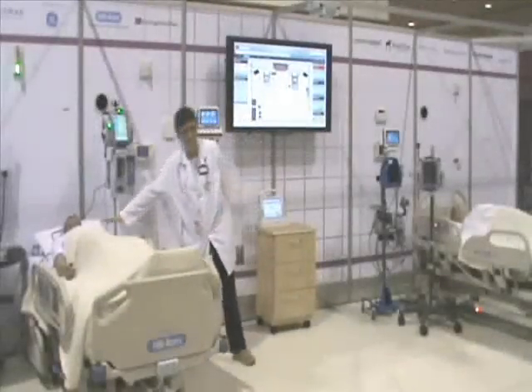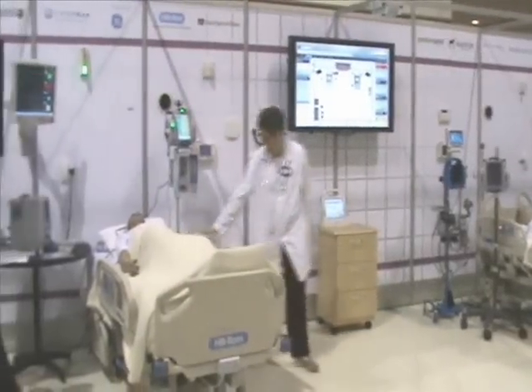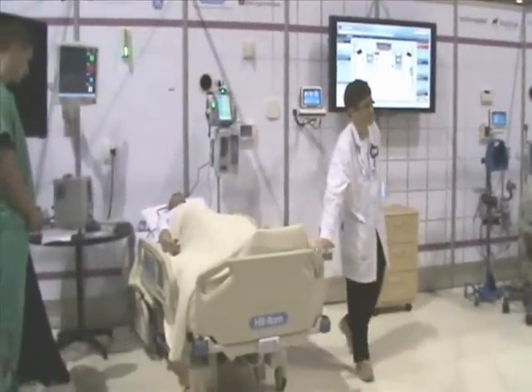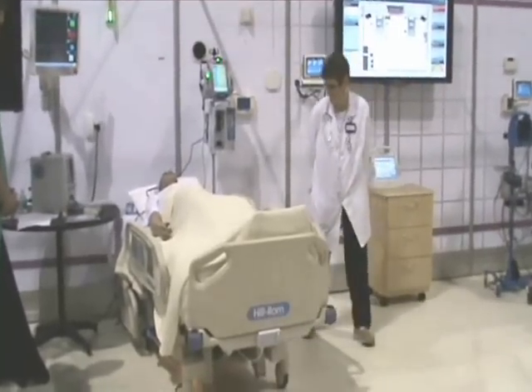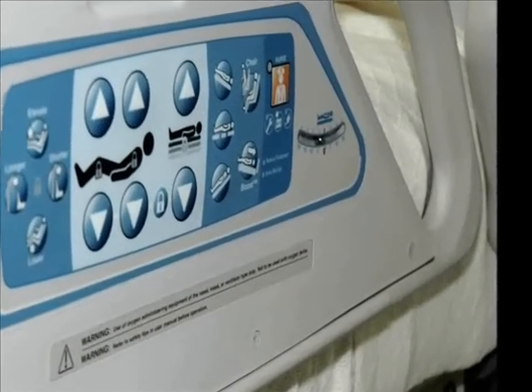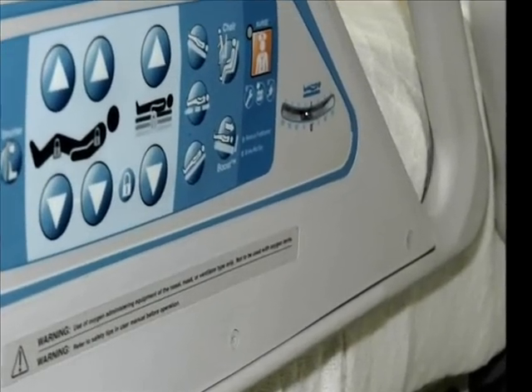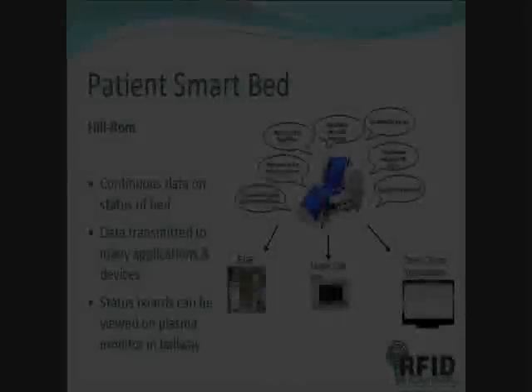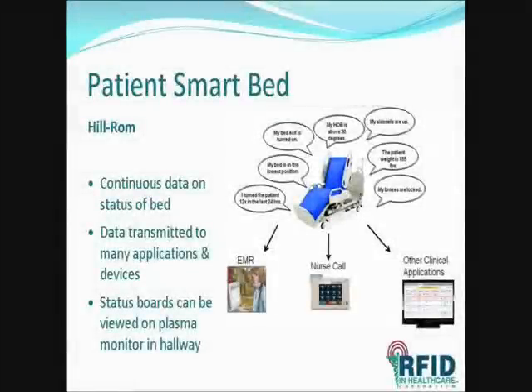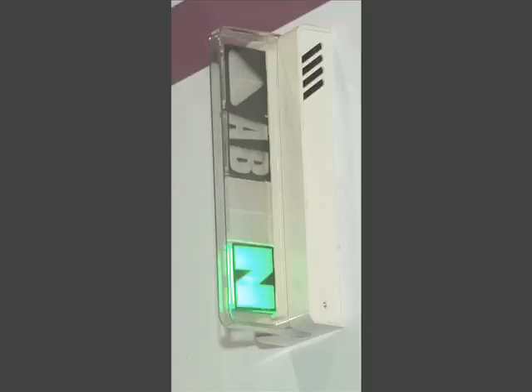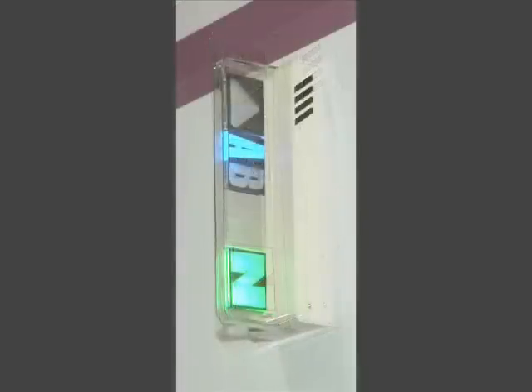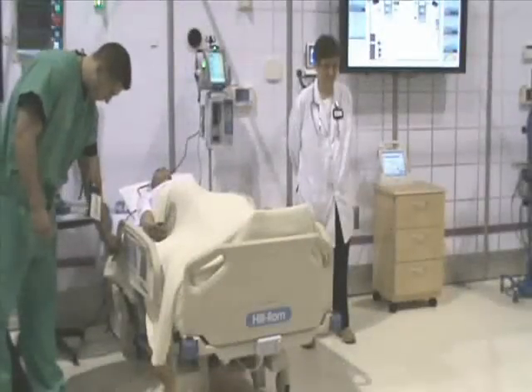Typical of high-acuity patient environments, our patient lies in an instrumented smart bed, providing the capability of monitoring patient weight, status of the rails and wheels, and patient communication. The bed can integrate with the nurse call platform, providing patient-to-staff communications and data about staff response or presence.